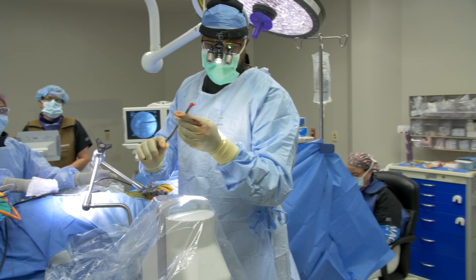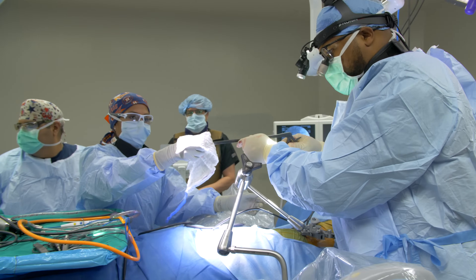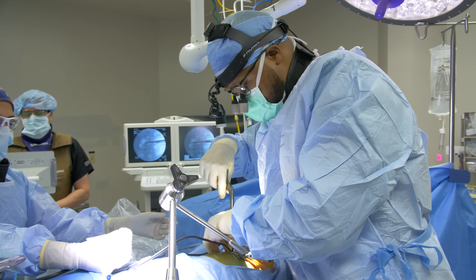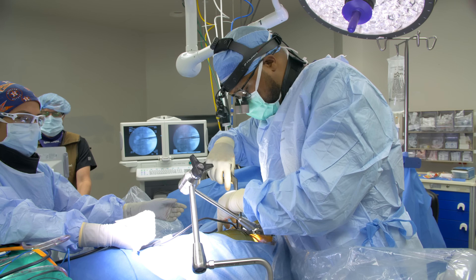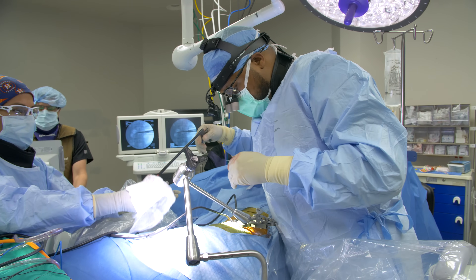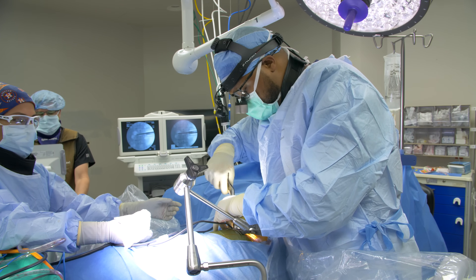This is the disc material we're pulling out. This is what's causing all of the pressure on his nerves. We're removing all of that disc to decompress him, and we're going to replace this void with the spacer in a moment.